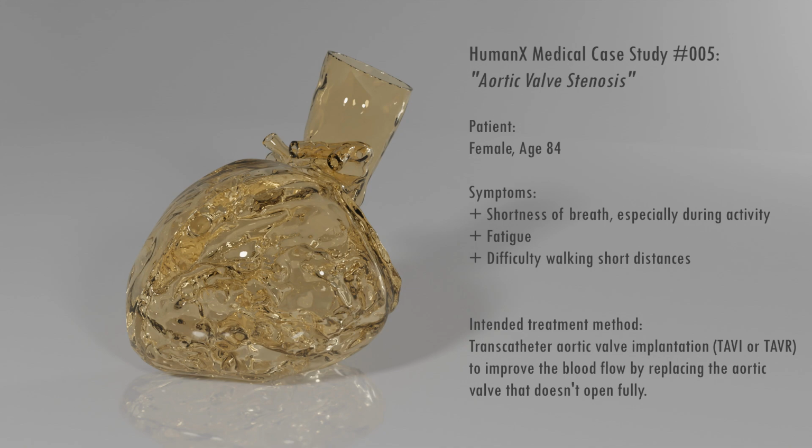Shortness of breath during activity, fatigue, and even difficulty walking short distances. To address this, the cardiovascular surgical team has planned a transcatheter aortic valve replacement, or TAVR. This minimally invasive procedure replaces the narrowed aortic valve, restoring proper blood flow and alleviating the patient's symptoms.